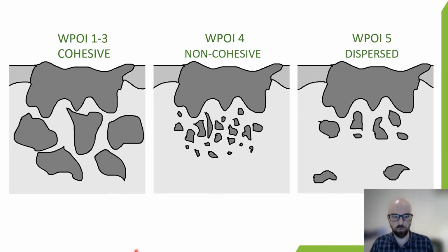Then you've got pattern 4, which is this non-cohesive group here, and that has small infiltrative nests which are less than 15 cells in size. And then the actual one which you really need to pick up on is pattern 5. That one has microsatellites which are greater than 1 millimeter away from the main tumour focus. The way in which you classify this is by picking out the worst pattern of invasion, and then it falls into those categories.